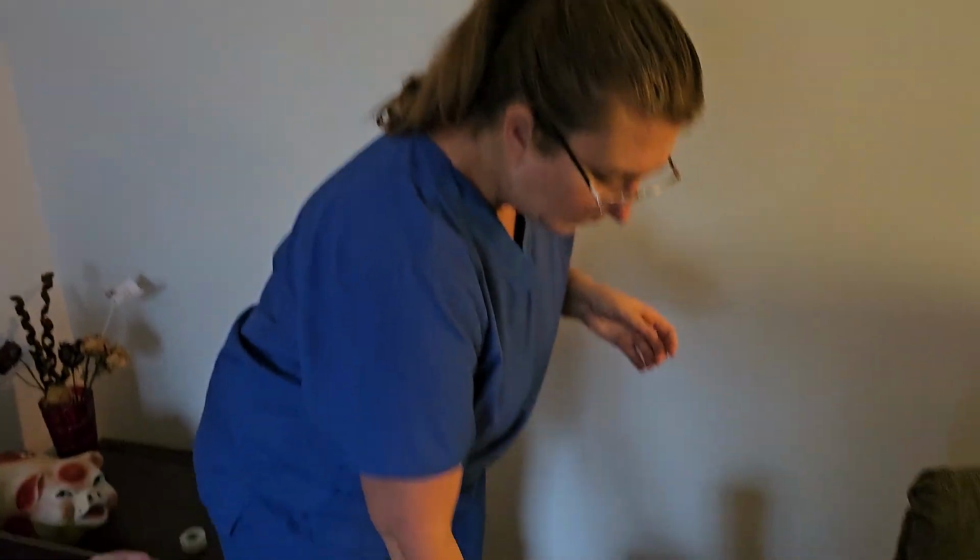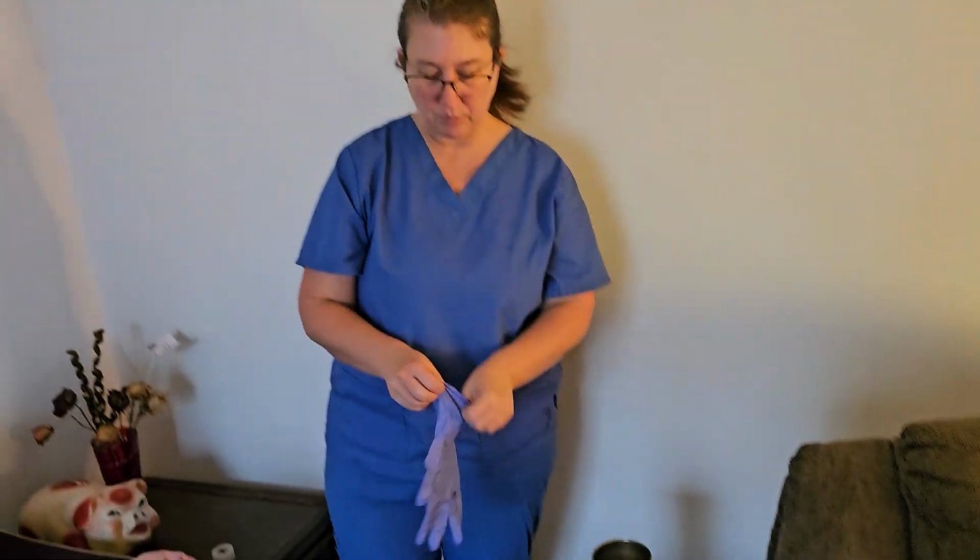So we will go to our patient, and we will either shut the door or pull the curtain. We will perform hand hygiene, and we will put on our gloves.